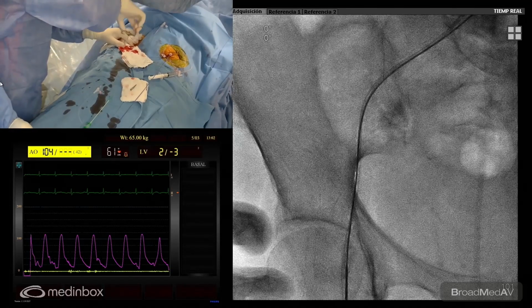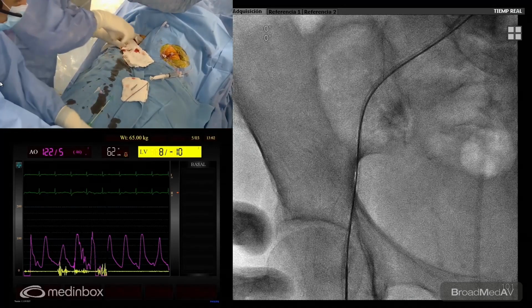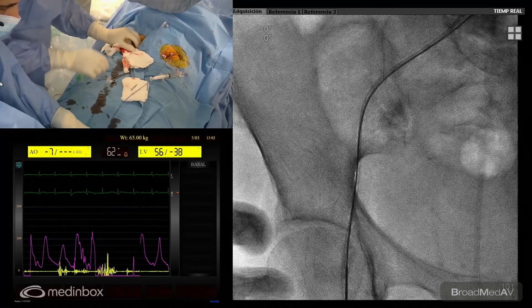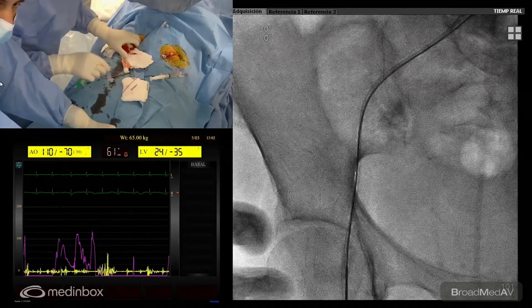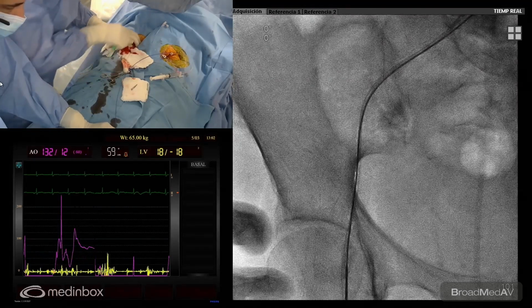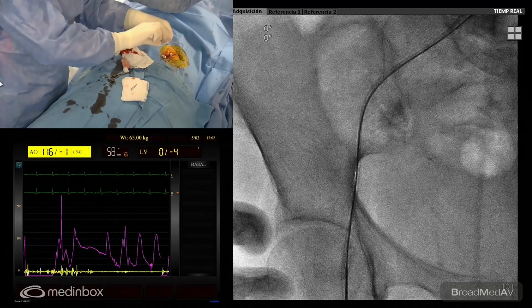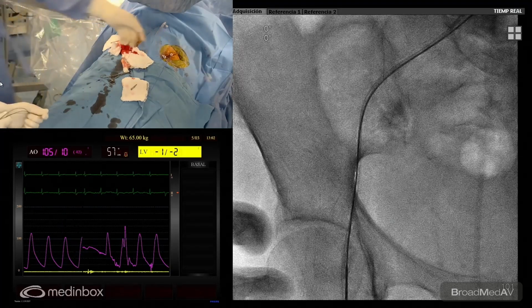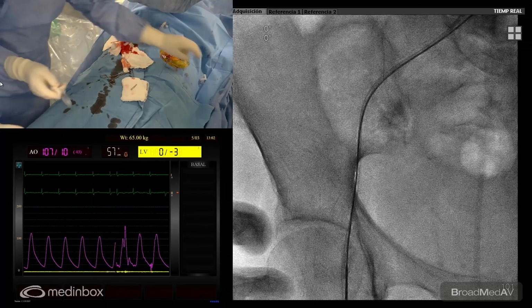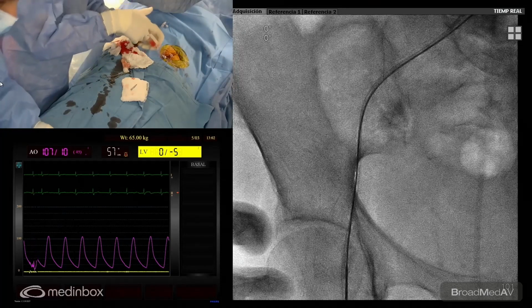Make a trajectory here. So then we have a perfect movement of the suture when we finish the procedure. We are going to put the 6 French introducer set. We are going to complete the heparinization with the full doses. Probably we have to check the zero of the blood pressure because I think it's not right.